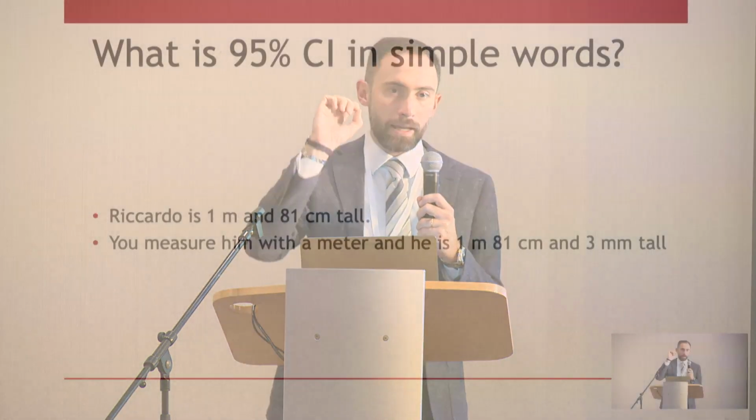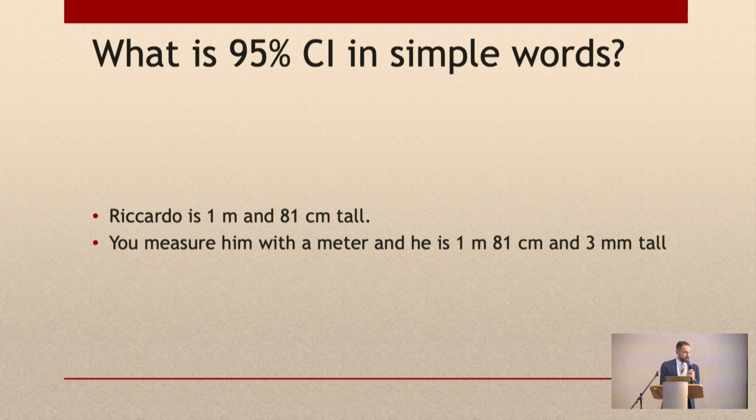But we don't know that when a patient is coming 3 months later. So the only way to know is that you measure me here, standing, 3 times, and you see what the measurement error is. The 95% confidence interval is this. So you get a 5% chance to say that I got taller and I was not taller. That's it. Very easy. So it says you have 95% chances to be right if you say that it's progressive. Okay?